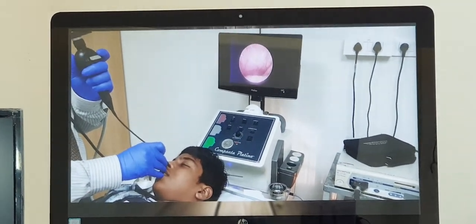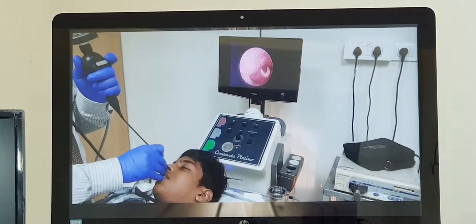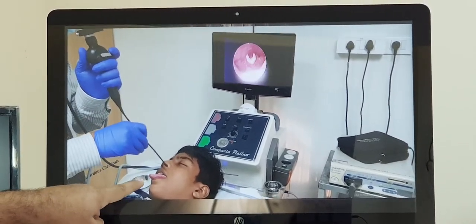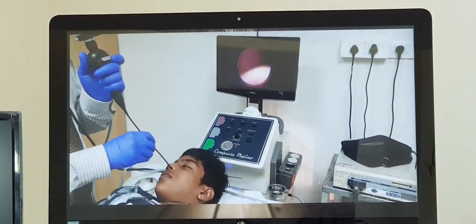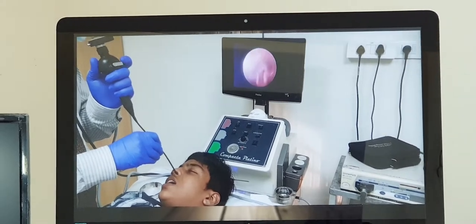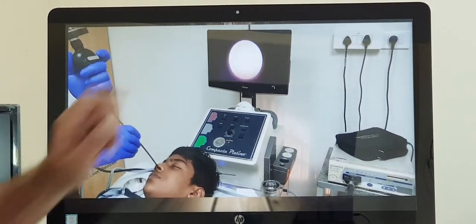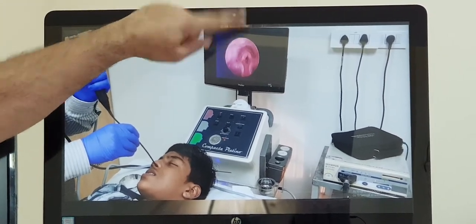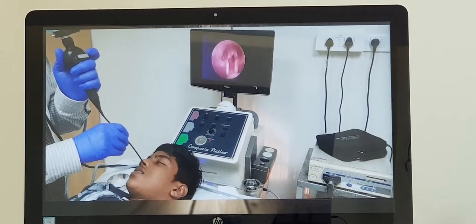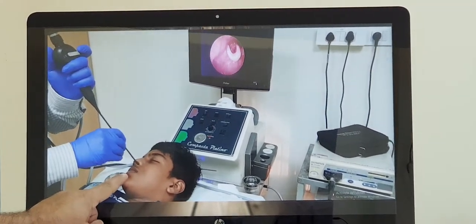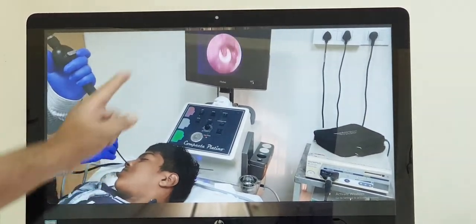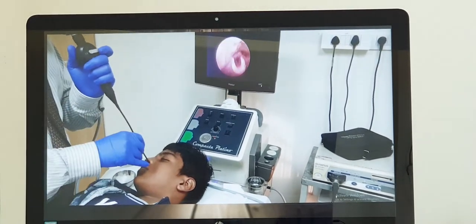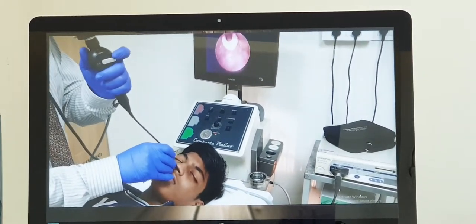Once that part is opened up, the endoscope will proceed down to the oropharynx — the area behind the tongue — and I ask him to protrude the tongue so I can examine the area behind the tongue as well as the area called the vallecula. Then I have a look at the voice box, examining the movement of the vocal cords, checking for any mass lesion. Both vocal cords are moving normally. I instruct him to say the word 'E', then turn his head to the right so the left side opens up, then to the left so the other side opens up.